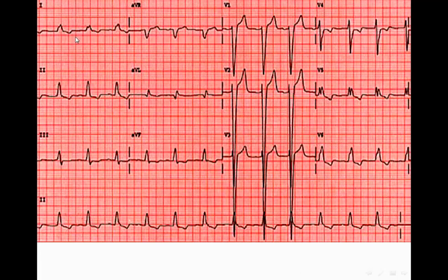Here is another example. We have a very clearly wide QRS complex, so this patient also has bundle branch block. Right or left — again, V1 and V2, and V5 and V6. V1 and V2 here show a wide deep S wave. V5 and V6 show the M-shape with inverted T waves in the left precordial leads V5 and V6. So this patient has left bundle branch block.